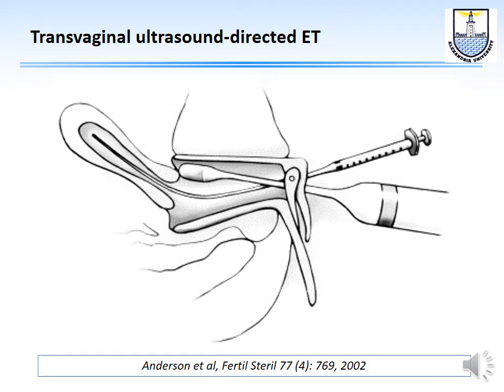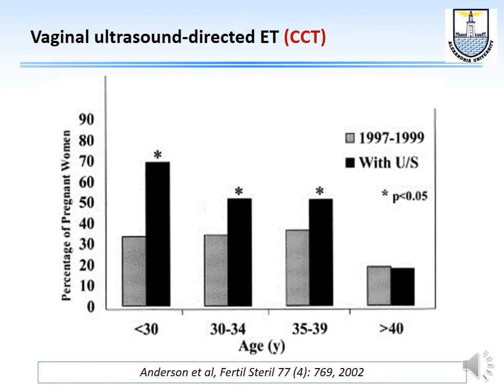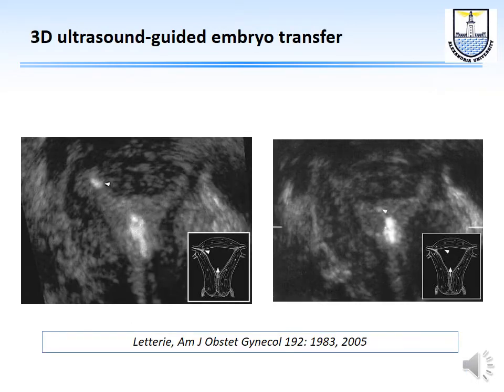All what we were saying before was about abdominal ultrasound guidance, but some people also use transvaginal ultrasound guidance, which is a bit cumbersome, of course, but some people use a very slim vaginal transducer, and they claim that they can do this. As you can see here, this is the vaginal ultrasound study, and some people even used 3D ultrasound. The group of Professor Alan Cherney, when he was still at the University of California, Los Angeles, UCLA, published in 2005.